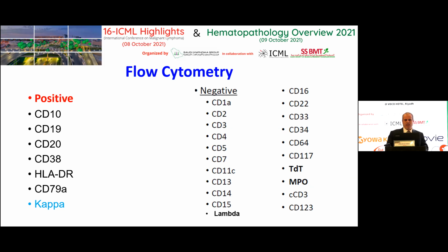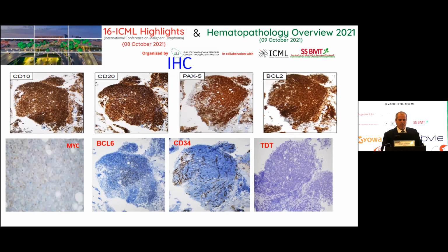If the pathologist tells the clinician, I have B-cell lymphoma with aggressive morphology, it means we have a frequent apoptotic pattern. We have a starry sky appearance. We have a high Ki-67. We usually have medium or large cell size. It is called aggressive morphology. So we also did immunohistochemistry to confirm.